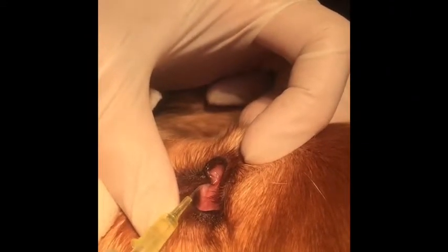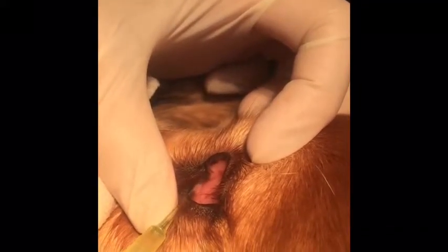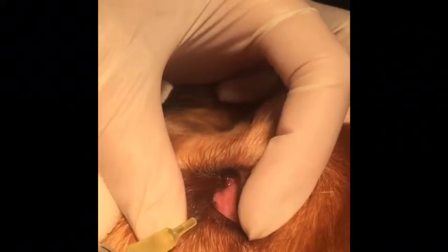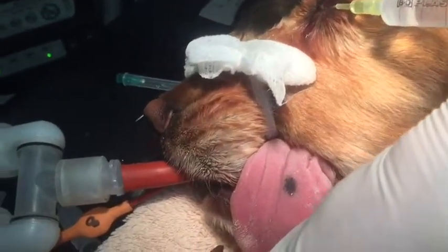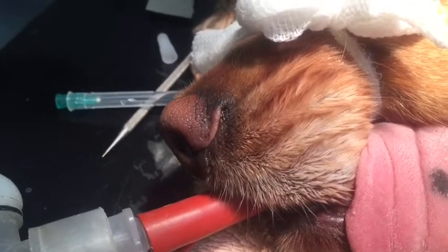To start with, as I flush the fluid through, you can see it coming back up on the dorsal lacrimal puncture. So I just need to put a little bit of pressure to block that canaliculi, and then that provides enough pressure to allow that nasolacrimal duct to be flushed.